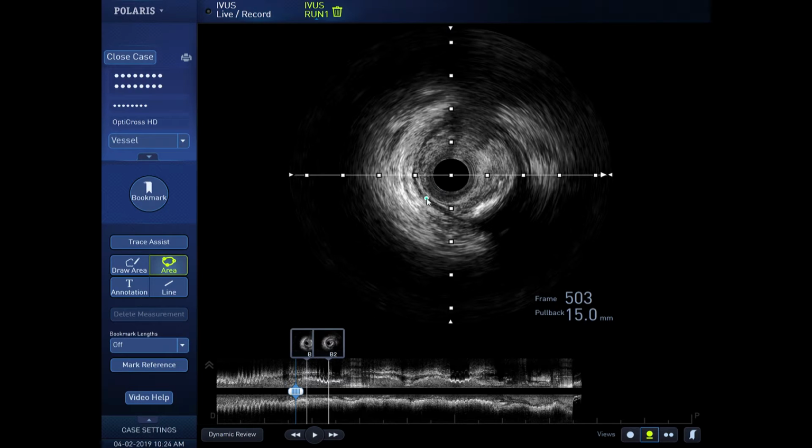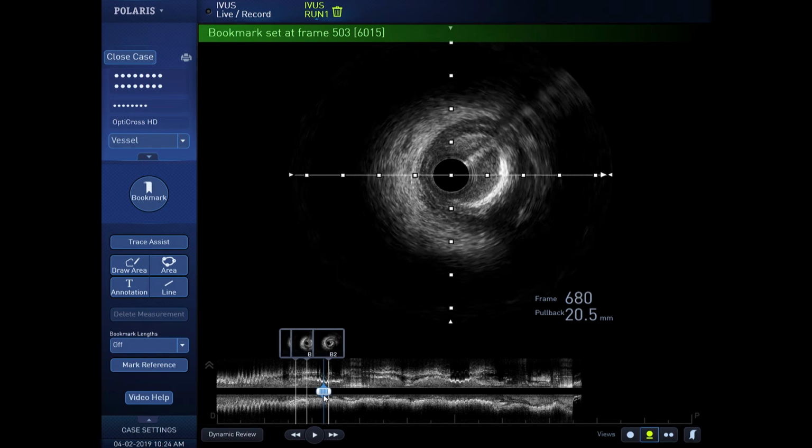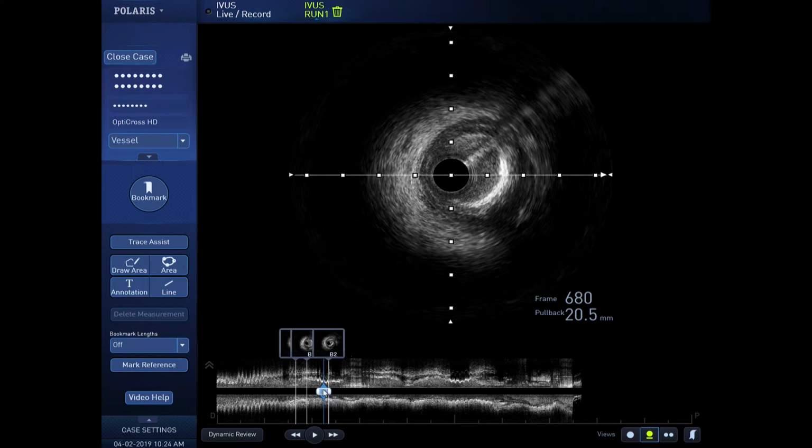Maybe you can tell us, Dr. Klassen and Dr. Justino. We just want to show you how calcium or normal plaque looks under IVUS. So let's go to the right here. Stop here. You see that bright area, which is 3 o'clock to 6 o'clock. You can see that calcified fibrous plaque. Not a lot of calcium, but calcified fibrous plaque.